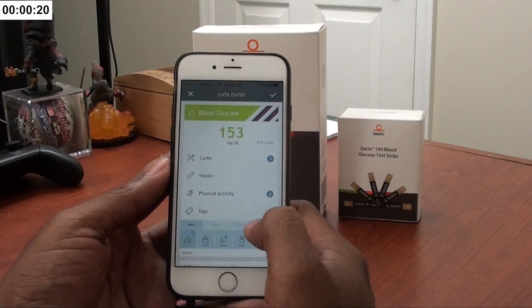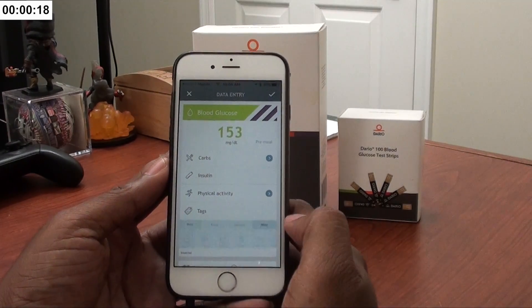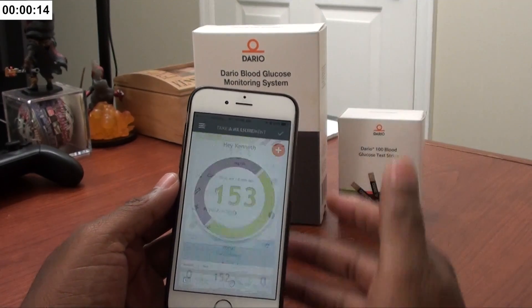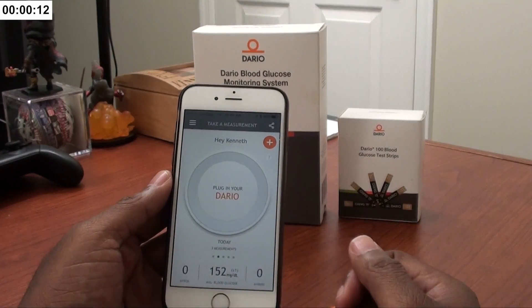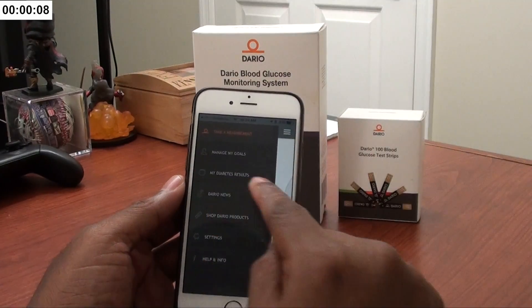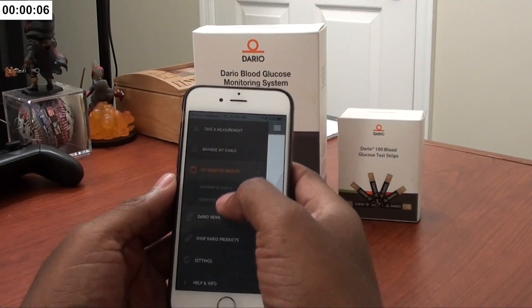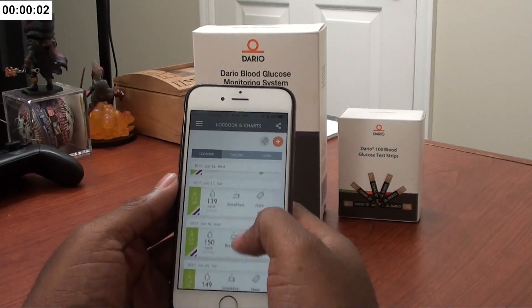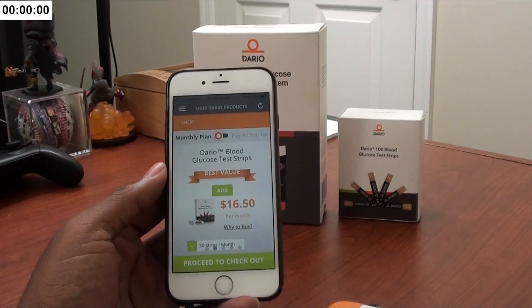One thing I like to do is also put in a note. Once you've done all of your note-taking, you're good to go. You can go back and look at all of your other readings — go to 'My Diabetic Results,' check out your chart, and see all the readings you've taken with this device so far.